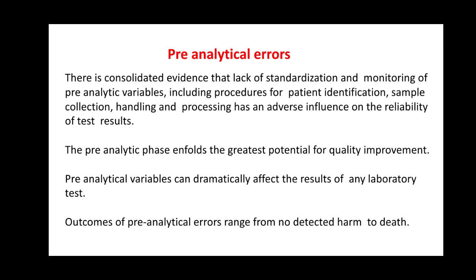If there is a lack of standardization and monitoring of pre-analytical variables, including procedures for patient identification, sample collection, handling and processing, the reliability of the test results may vary. So errors that occur before the processing of a sample come under pre-analytical errors. Sometimes, other than the variables of specimen collection, we may come across some other factors also. The pre-analytical phase has the greatest potential for quality improvement of a lab, and pre-analytical variables can dramatically affect the result of any laboratory test.